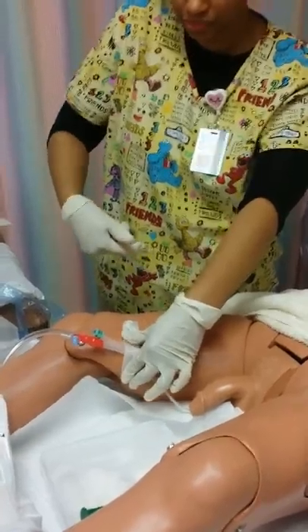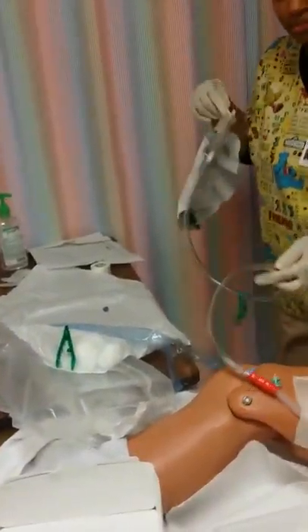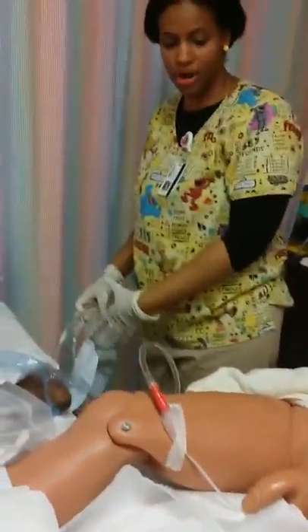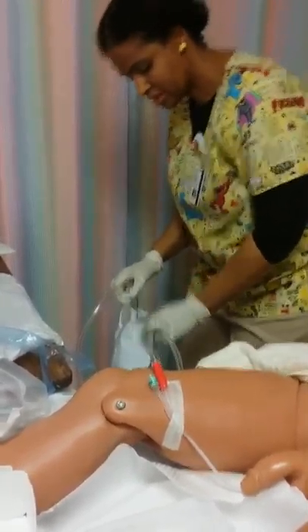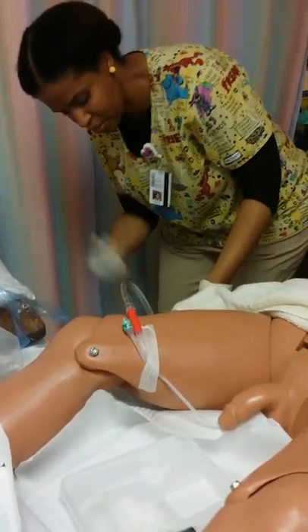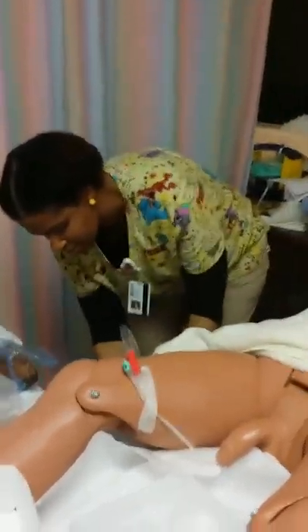Okay, and that's done. So I'll go ahead and pull the urine bag out, ensuring that there's no kinks. Okay, so they said to always hold this below the bladder because gravity is everything. If you hold it kind of level up, you run a chance of the patient getting an infection. So we don't want that. So I'm going to hang it on, never on the rail either, because the rail moves back and forth. So I just hang it on the side of the bed. And there's a place for it. Okay. Make sure it's secure.